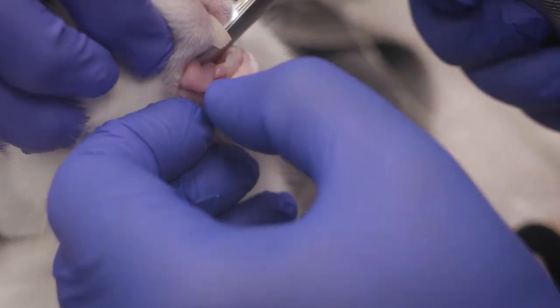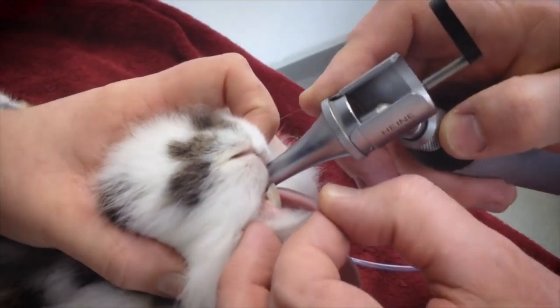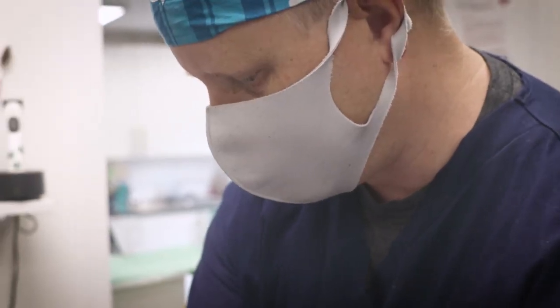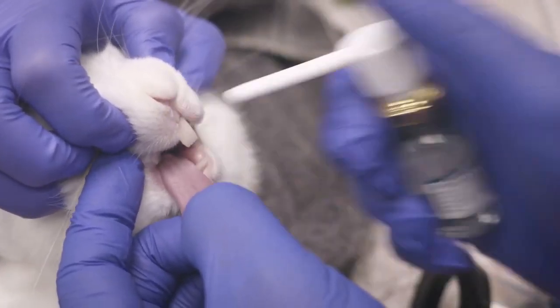Withdraw the tongue and examine the mouth and pharynx of the patient using a laryngoscope or otoscope. Remove any foreign materials and suction any excessive secretions that are seen. It may be appropriate to apply a dose of topical local anaesthetic to the larynx depending on the clinician's assessment.